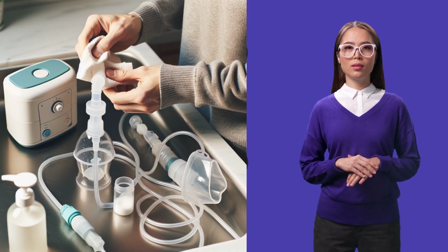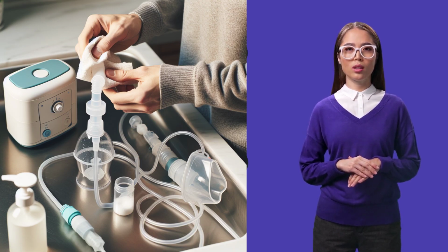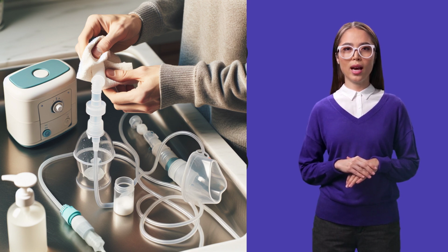After treatment steps. After the treatment, turn off the compressor and disconnect the tubing. Dispose of any remaining medication from the cup. Rinse the medication cup, mask, and tubing with warm, soapy water and let them air dry. Store the nebulizer in a clean, dry place for future use.